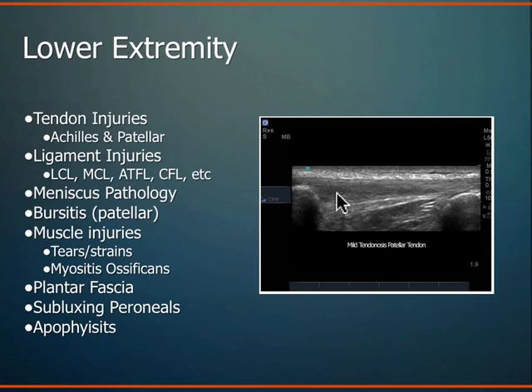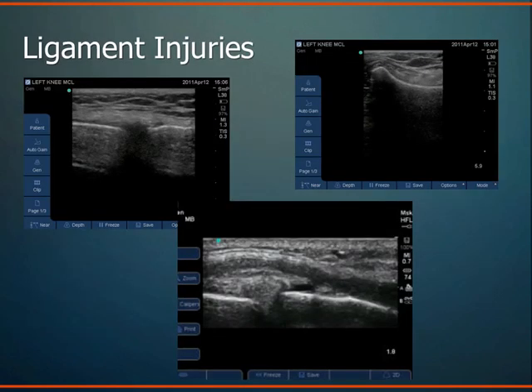And then around the ankle, you can visualize those peroneal groups, ATFL, anterior talofibular ligament, all the common ligamentous structures that you see in your common ankle sprains. All these bursal sacs tend to be very superficial. You can image those quite well. And again, those muscle tears, muscle strains, full ruptures, hamstring tears, a very, very common injury in sports. You can see that quite well on ultrasound.